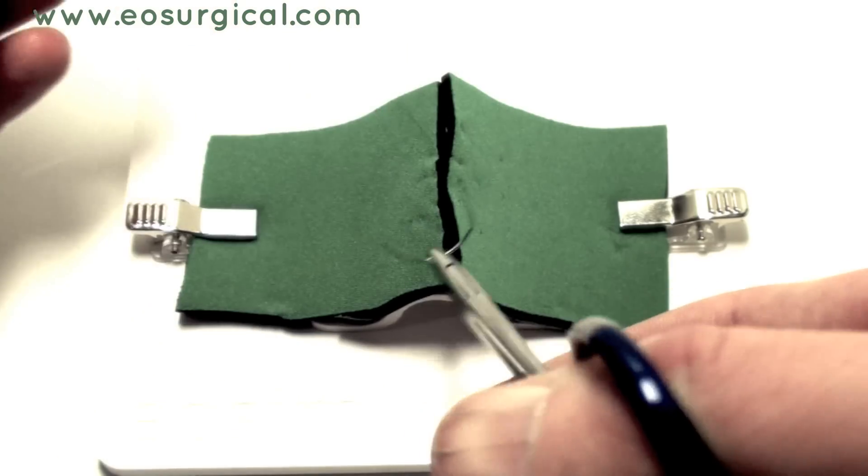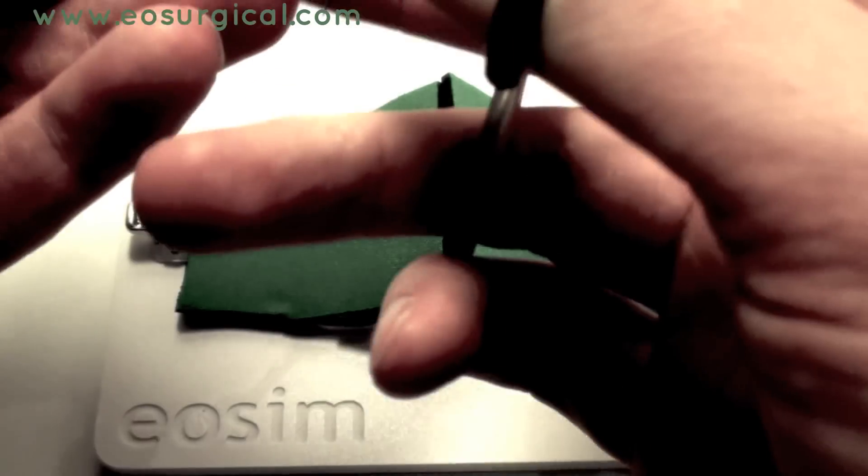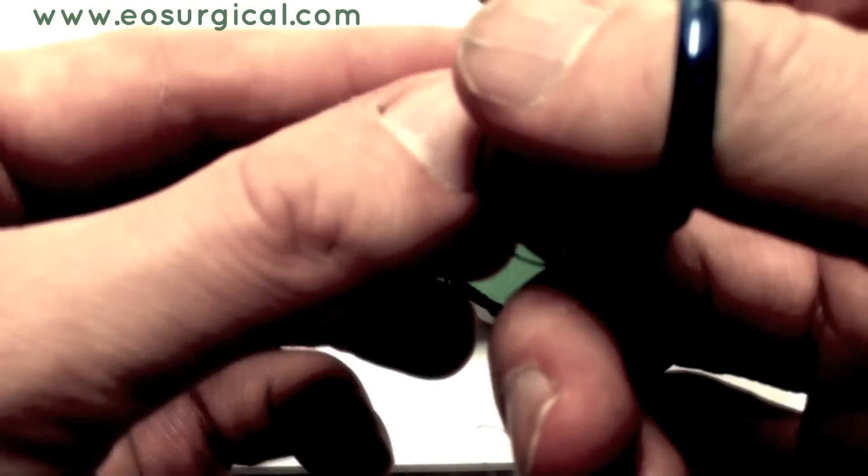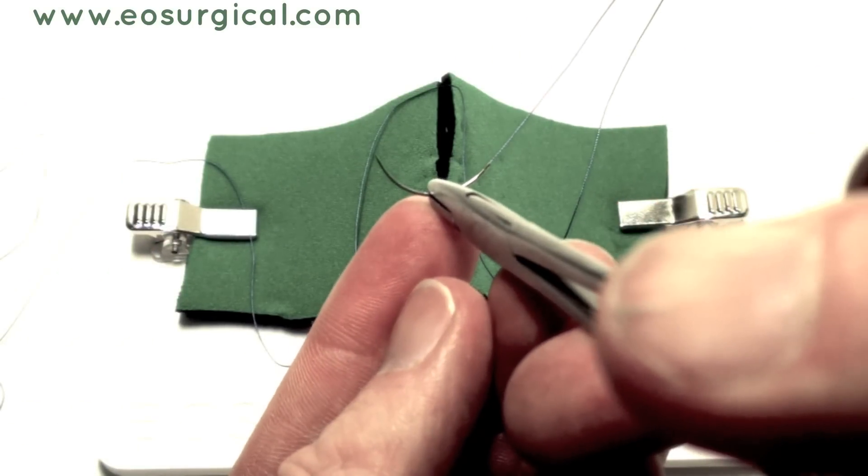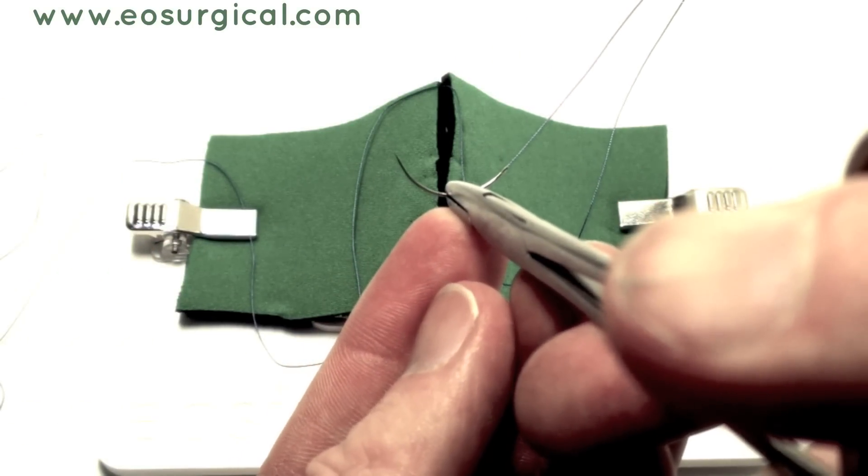First of all, make sure you mount your needle correctly. To do this, you need to grasp the needle roughly two-thirds of the way along its curvature as shown here. Make sure you use the tips of the needle holder.